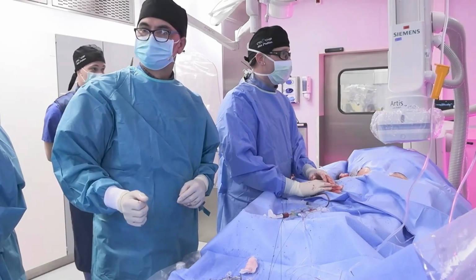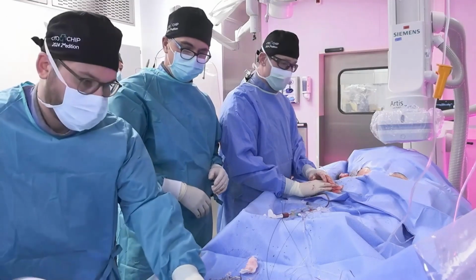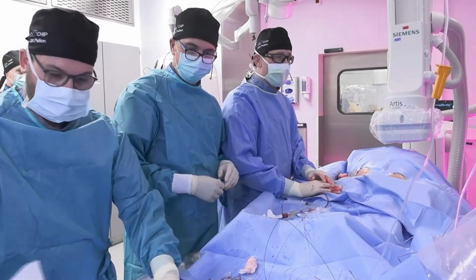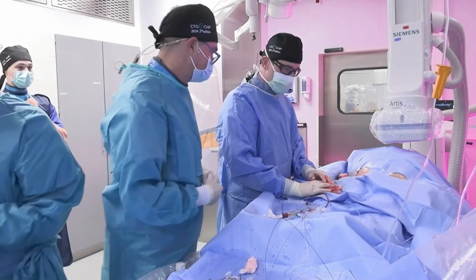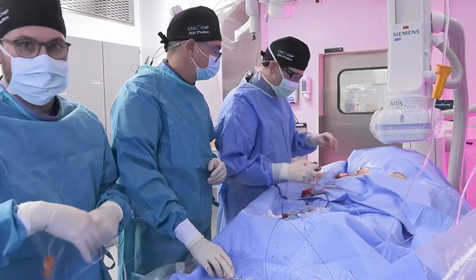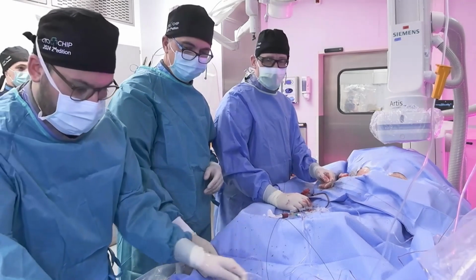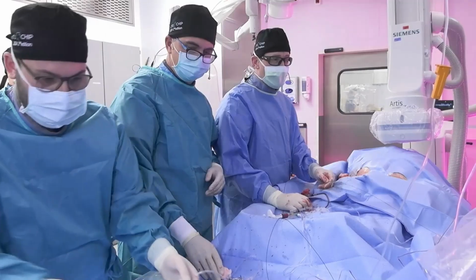Okay, is the case clear so far? We have seen the critical lesion in the mid RCA, followed by the CTO in the stent. So we have the subtotal occlusion of the RCA and then the blunt proximal cap. We have the bifurcation, which has unfortunately been stented. I've seen a picture of a relatively large RCA in 2017, so it's probably worth it.